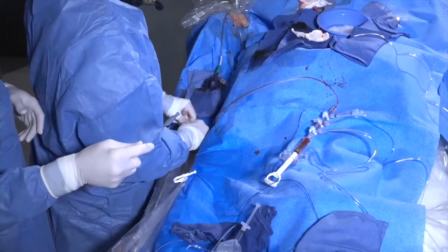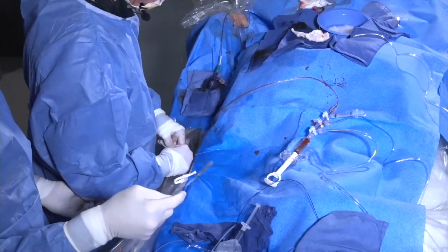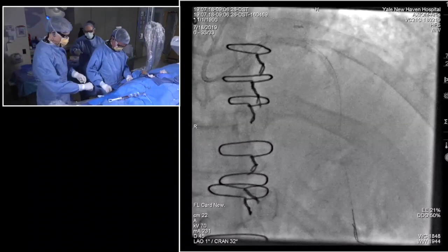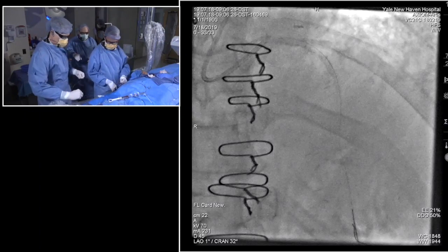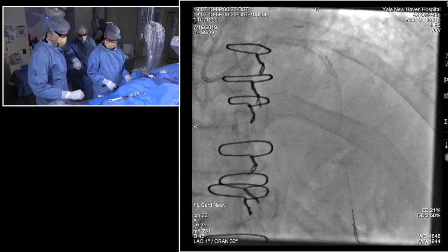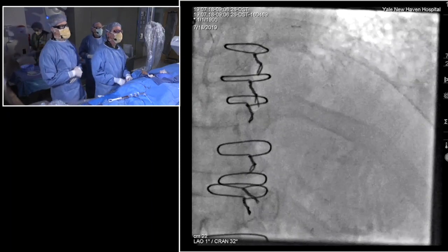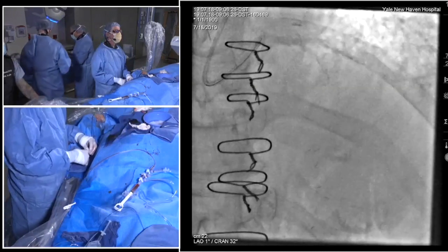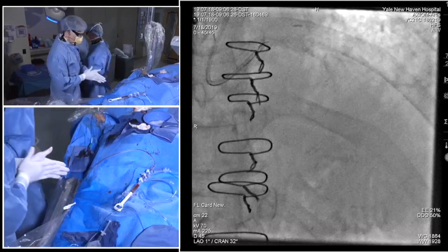All right, guys, so I think what we're going to do now, we've got things prepared. You're going to IVUS. Dilated with this 2.5 balloon at low atmospheres. It's time to see exactly what's going on. Yeah, and that'll help give you the stent size. Is to wire the diagonal. Give it a try.